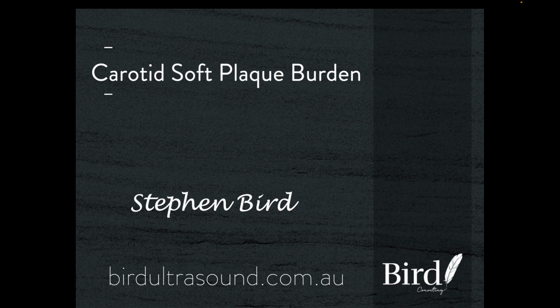Welcome to Case of the Week. This week's case is on carotid ultrasound, and I'm going to present a case where we found some significant plaque in the bulb area of a carotid ultrasound in a young patient, and how we go about dealing with this, quantifying it, reporting it, and how it can change the patient's management.